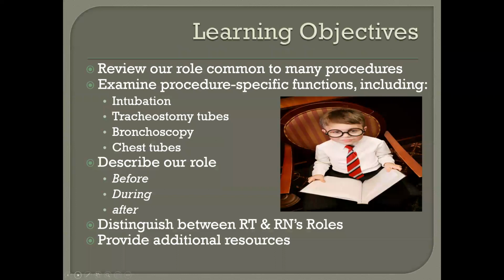Some of the learning objectives that we're going to look at here will review our role that's common to many procedures. I don't want to say irrespective, but there are certain things that are prudent and proper to do before most procedures, such as washing your hands, gathering your equipment, checking the physician's order to make sure it's there, and checking certain laboratory results.